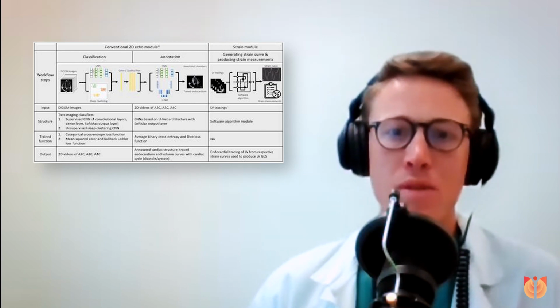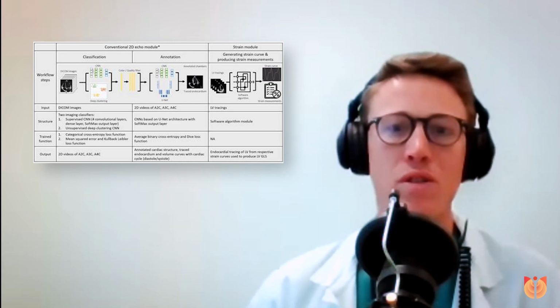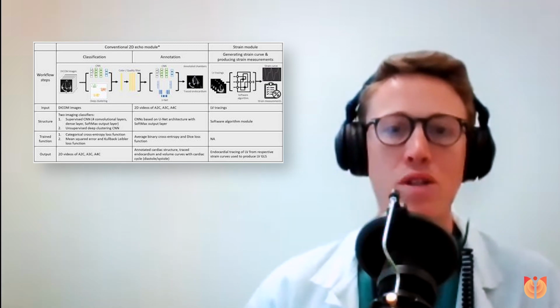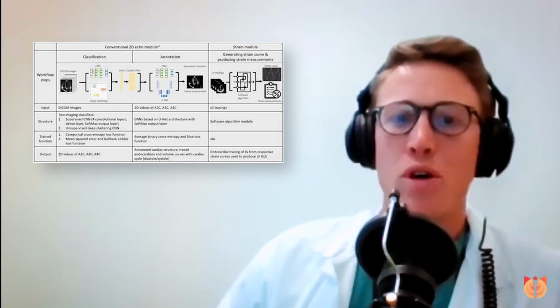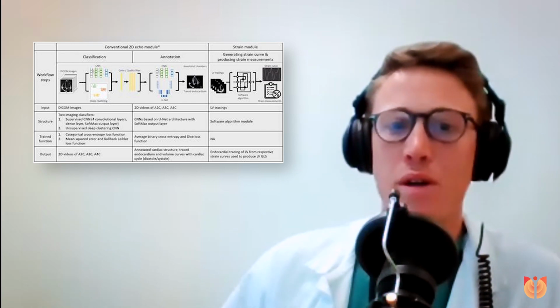The outcomes included measurements of agreement, that's bias, root mean squared error, and Pearson's correlations. We also measured the area under the curve to identify patients with heart failure and regional wall motion abnormalities. After automatically identifying and excluding low-quality images, high-quality 2D video clips are parsed into a CNN model, which traces the endocardial border for each frame.